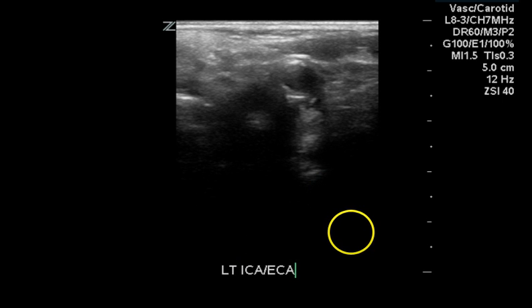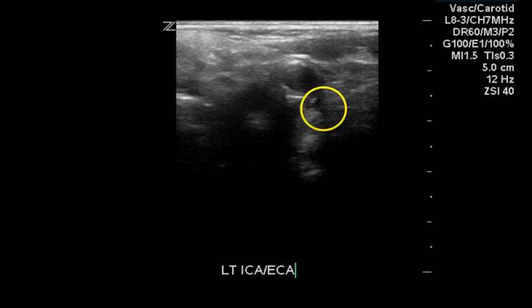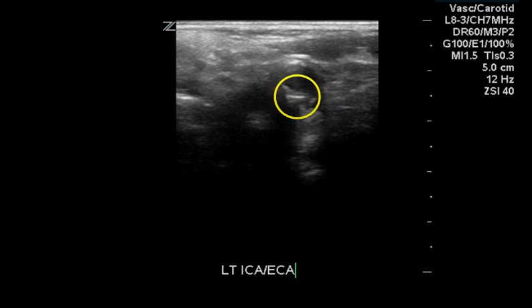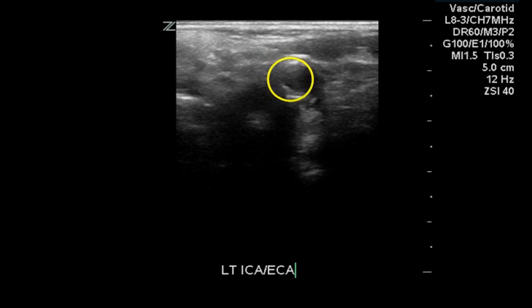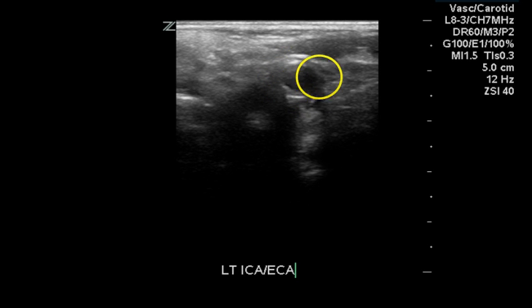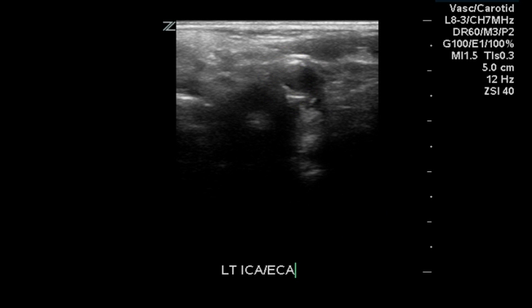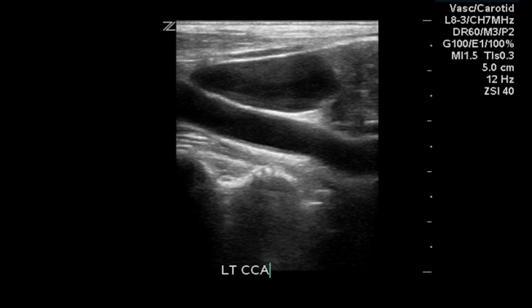This is the bifurcation imaged in a transverse fashion. I'm assuming the smaller vessel is the ECA and the larger vessel, which shows some circumferential plaque, is the ICA.